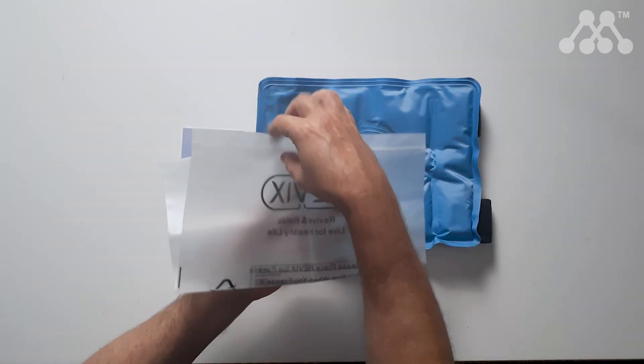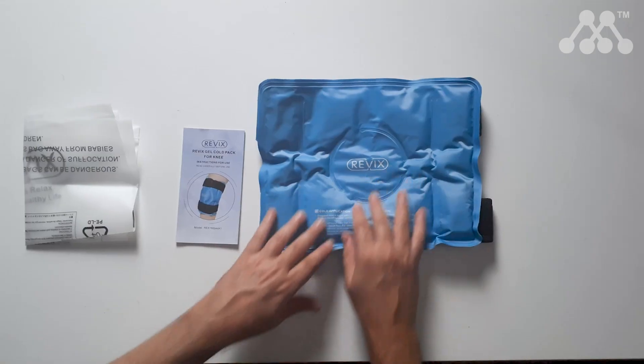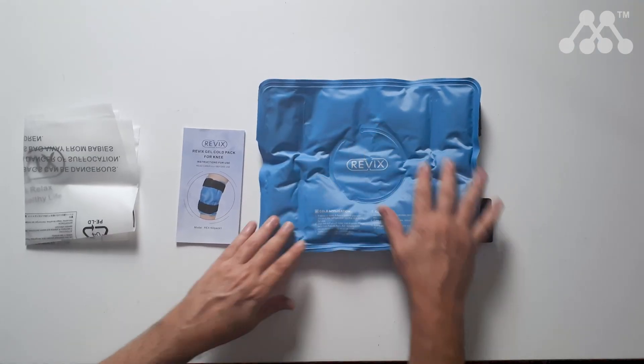You also get, as an added bonus, a nice little bag that you can use when you place it into a freezer. It is recommended that you put it in for a minimum of four hours to be able to use it. It's used to provide relief to a joint that may demonstrate some degree of swelling and/or inflammation, and while it is designed for the knee, you could possibly secure this to other parts of your body if needed.